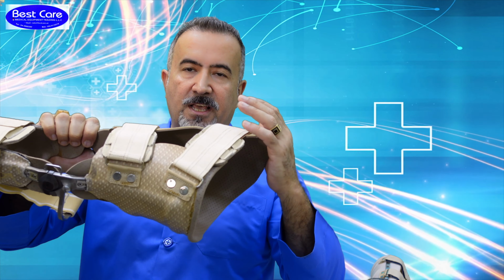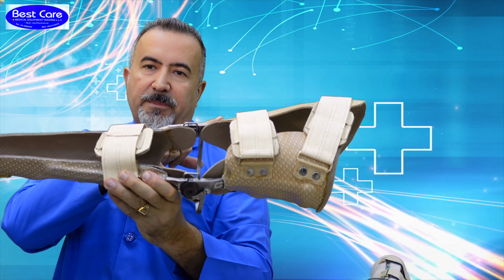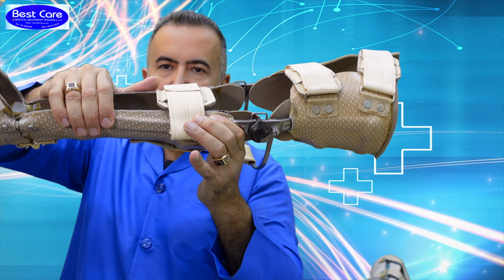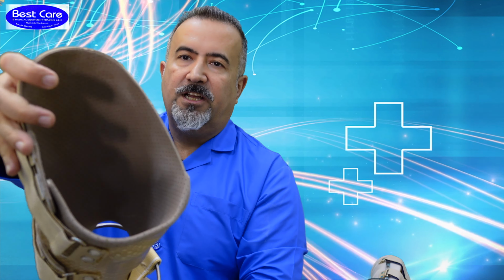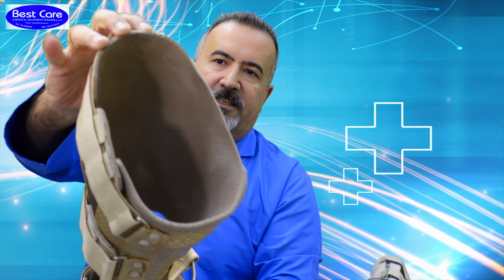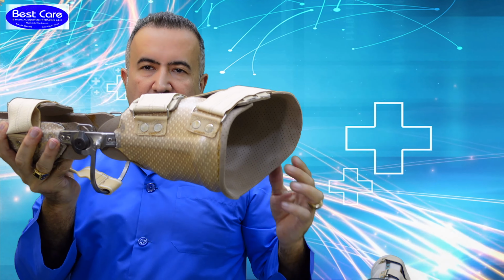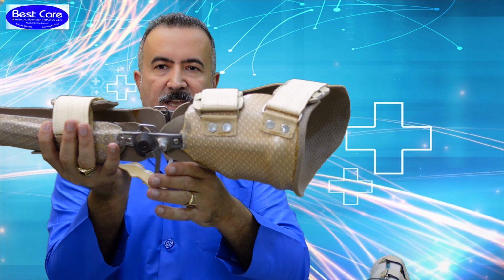And what about the material now? It's a different material. The previous one was laminated, but here, on the lower portion, we have solid lamination. Above we have flexible lamination. I hope you can feel it here. This is much more comfortable, but a bit more complicated in manufacturing.